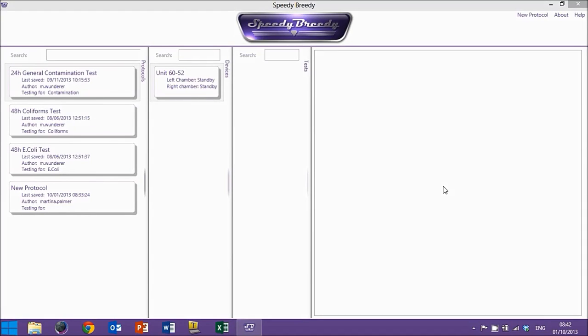Hi, this webinar will show you how to add a protocol to Speedy Breedy and then subsequently start a test from the software. If you are not familiar with the components of the software yet, please have a look at our Getting Started with the Software webinar.